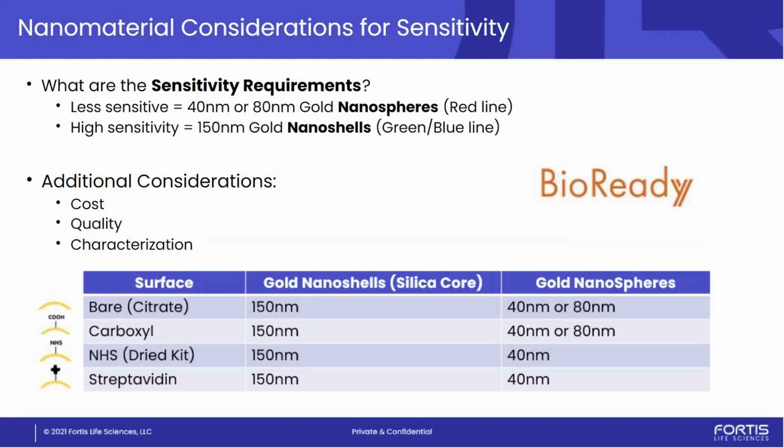And this just has to do with the fact that these particles, by virtue of physics, are just brighter and more intense. That's because they're physically larger. So these are 150 nanometers versus 40 nanometers. And as you can imagine, you see bigger things better because they can absorb more. But anyone who's worked with and made gold before knows that larger particles really have issues with flow characteristics in lateral flow. 100 nanometer gold colloid or 150 nanometer gold colloid won't flow very well, if at all, on lateral flow. Why is that? Well, it's because of the density, and they're functionally like little boulders rolling around.